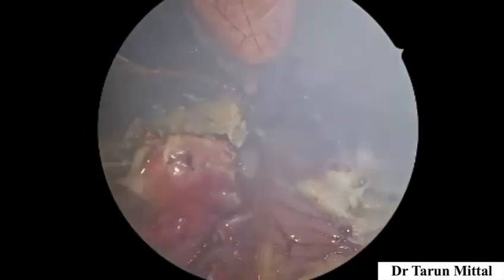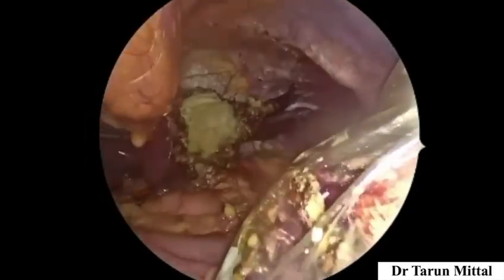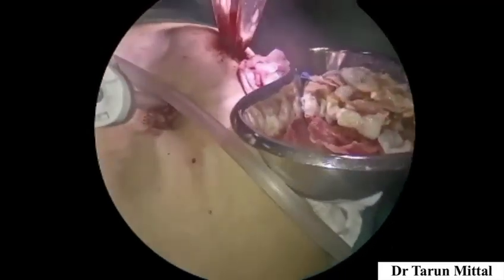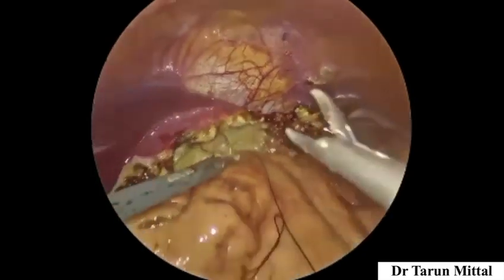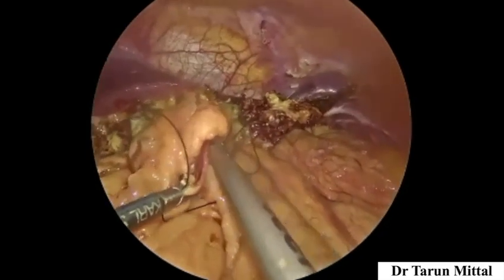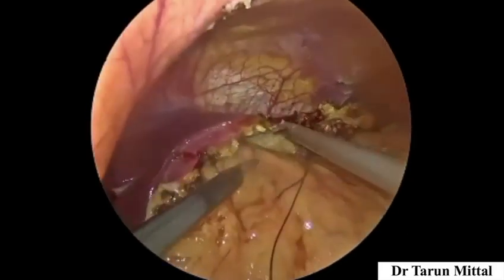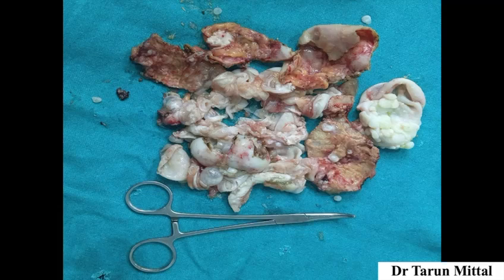Now all the ectocyst, brood capsules, germinal membrane and scolices are kept in the endobag, and it is removed through the 10 mm port which we have placed. Now, to close the cavity, we take the omentum and take a bite from the capsule cavity, so that the cavity gets closed and no fluid gets collected. This is the material which we have removed, and thank you.